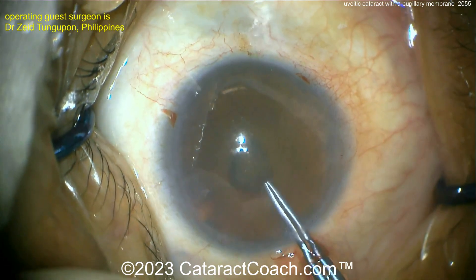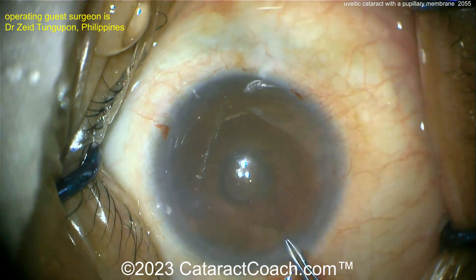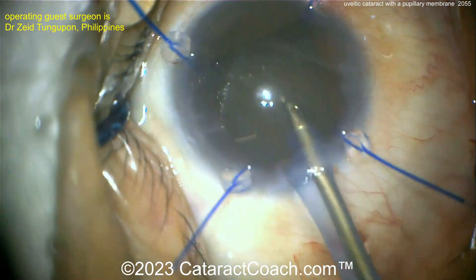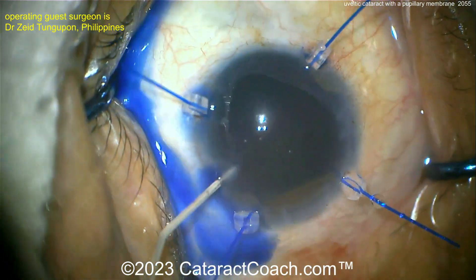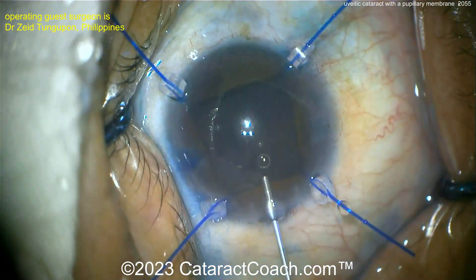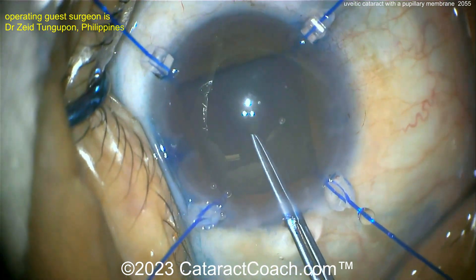You can almost do a membrane-orrhexis — tear it just like you would a capsulorrhexis, grab it, get a hold of it, and go around. After that's done, you can see the surgeon already placed iris hooks. Now let's look at the nucleus — it's a pretty dense nucleus. Trypan blue dye is good; put that inside the eye. Then more viscoelastic, and now getting the capsulorrhexis done.